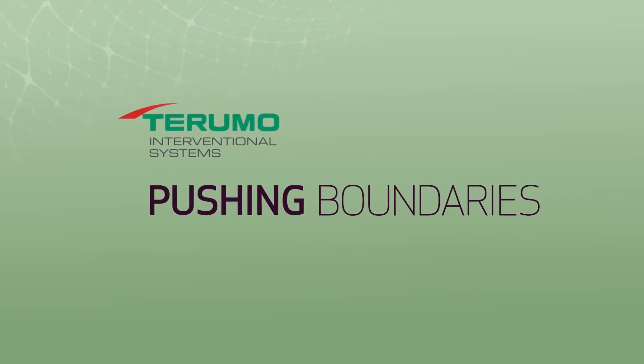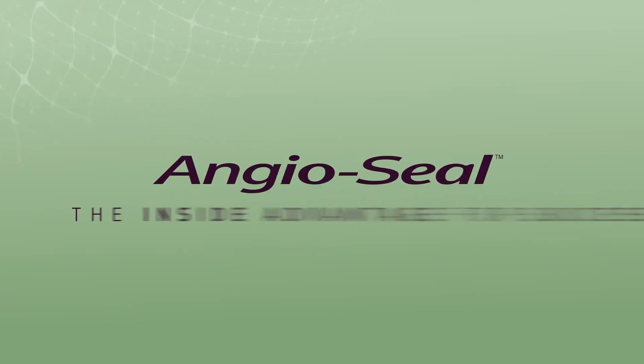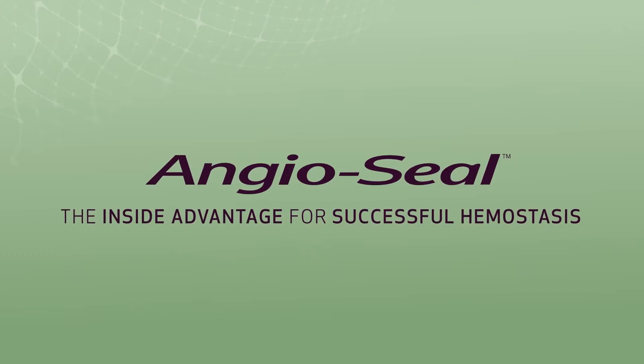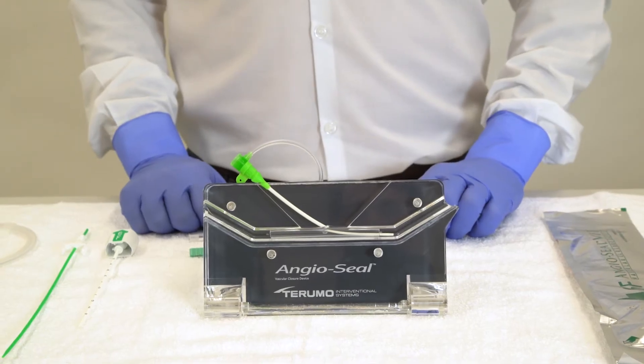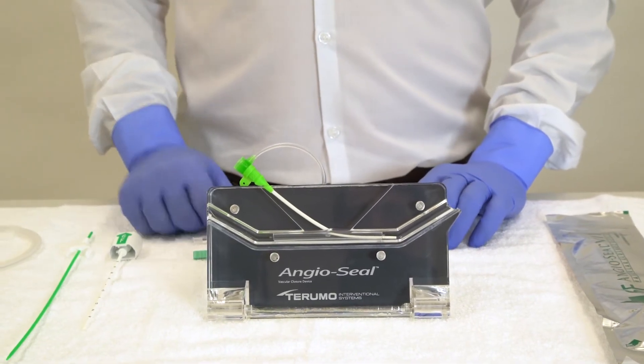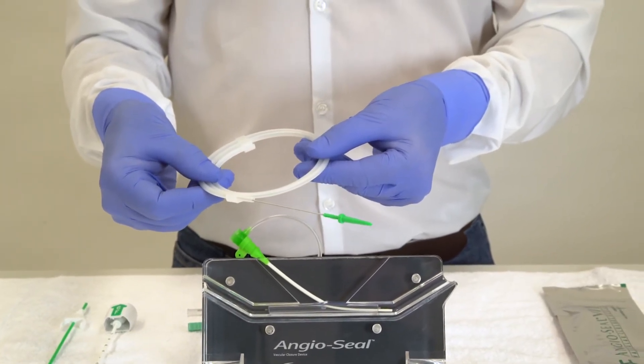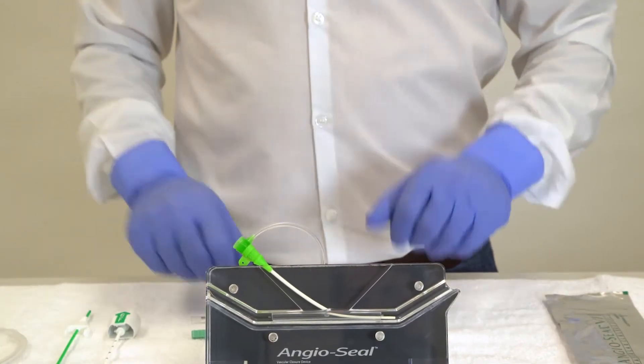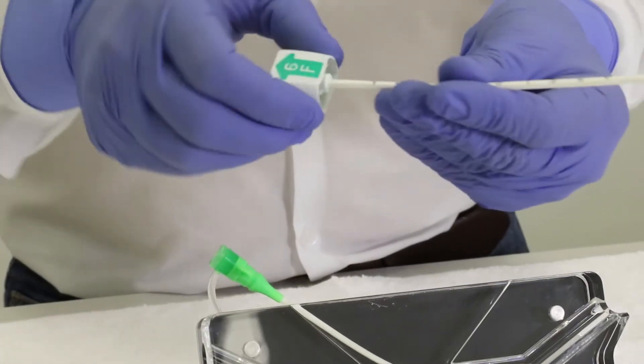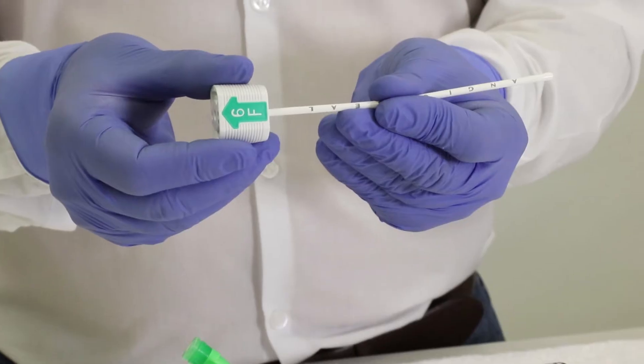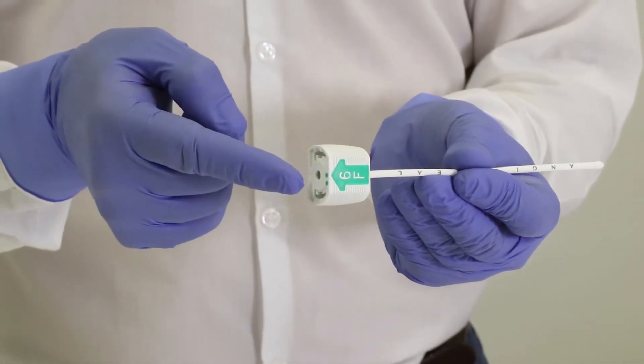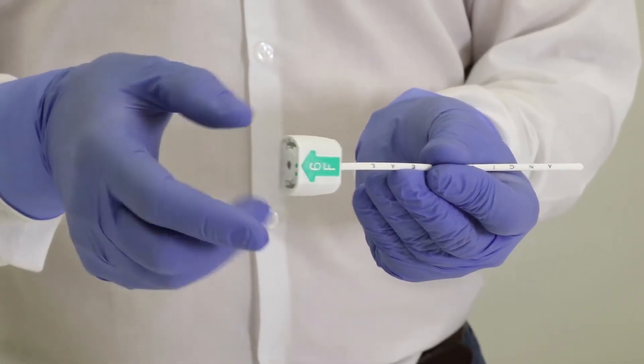In this video we will show the deployment of the Angioseal VIP vascular closure device. These are the accessories that come with the device: a wire, 0.035 for 6 French or 0.038 for 8 French, and a sheath. This is a modified sheath with a hemostatic valve here at the top and a modified tip, a bit longer on one side.